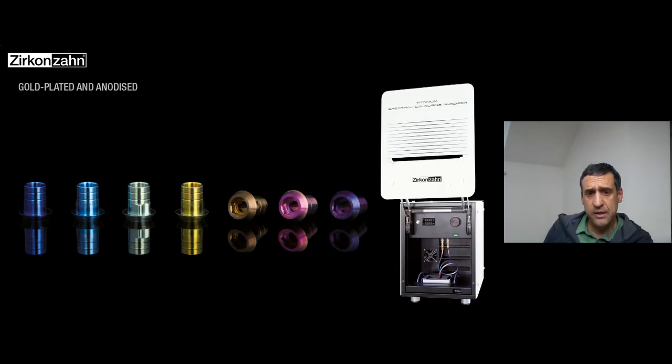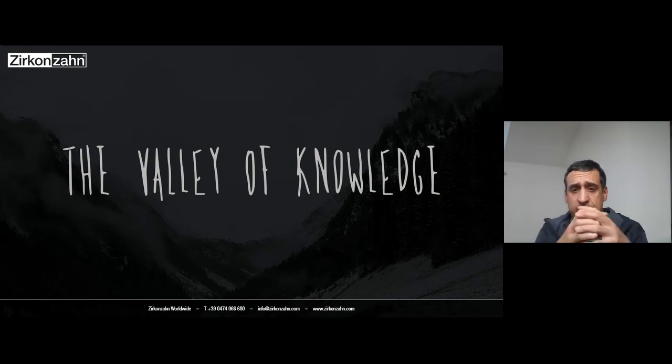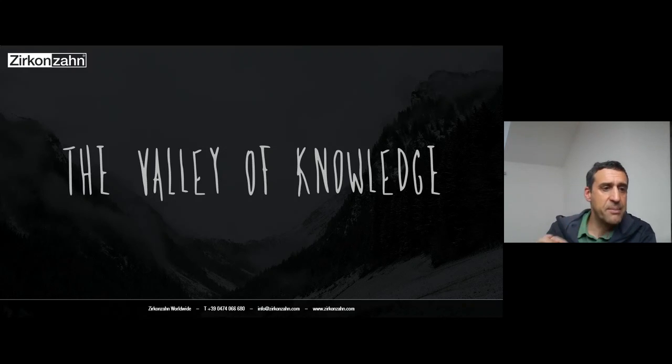Of course, there is also the titanium anodized coloring machine, a device you can buy, and you can have different colors. You can have a really large range of colors of titanium. That really helps sometimes. Sometimes pink or gold helps when you have a really thin thickness, and it also helps in the cementation. You can have a really good cementation on top of the base.